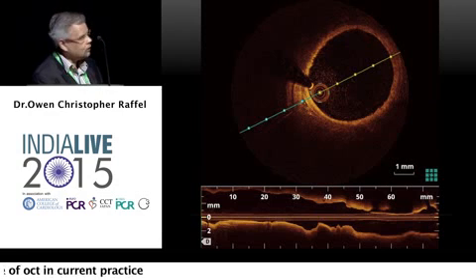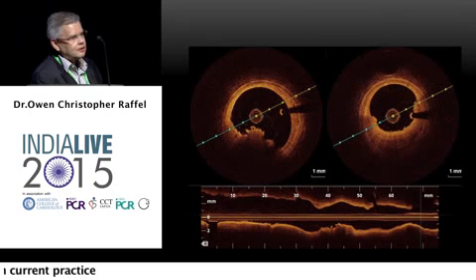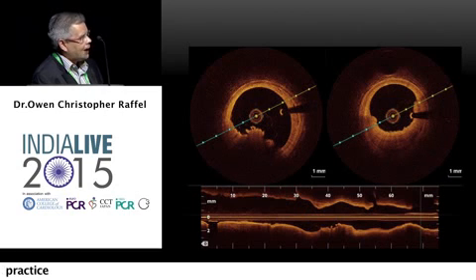Unfortunately, I can't control it from here. But you might see at the OCT down here, you see something which reflected where that spasm was. And this is what we saw. In fact, there is a thrombotic lesion with some eccentric plaque, which was a fibroatheroma, and this is a typical appearance of what plaque erosion is like.